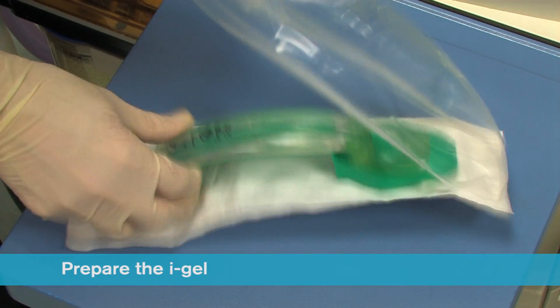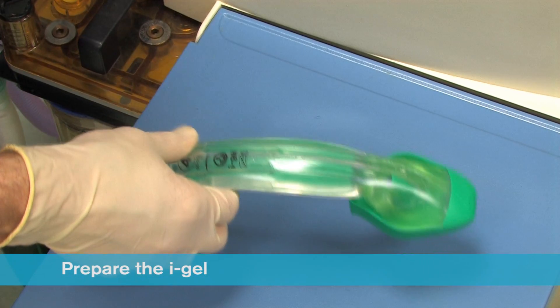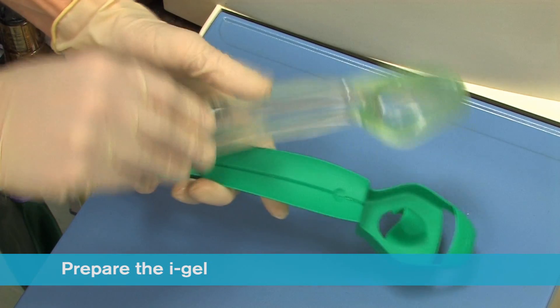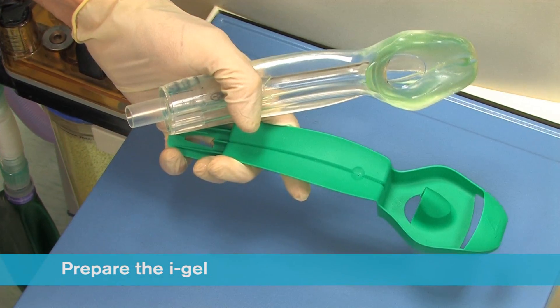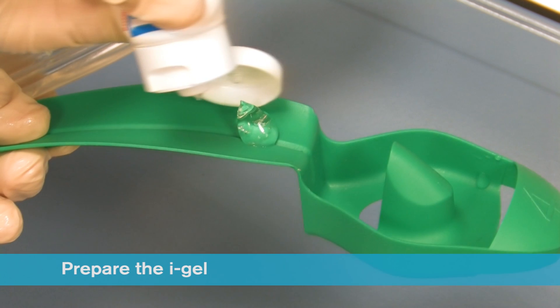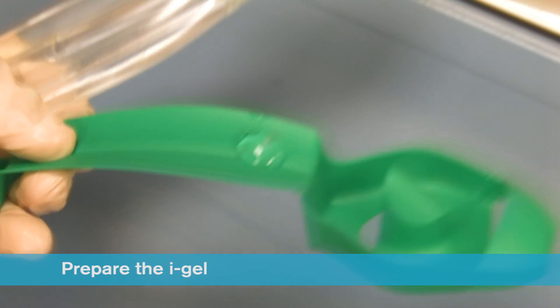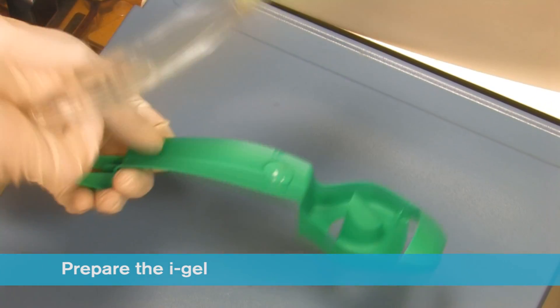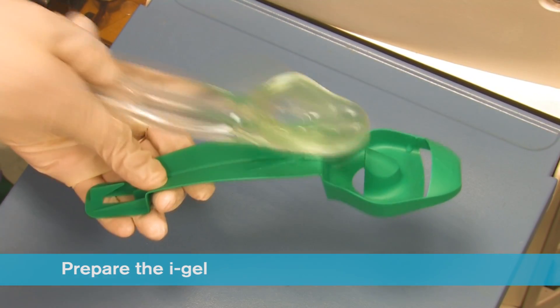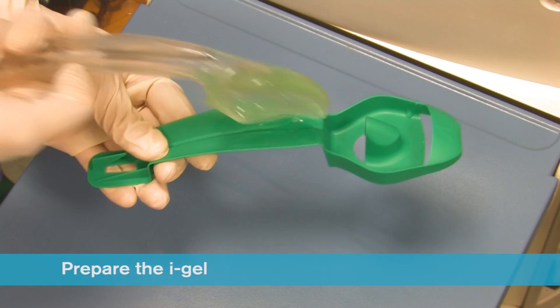Ensuring that you conform to local policy for hygiene, open the iGel package and on a flat surface take out the protective cradle or cage pack containing the device. In the final minute of pre-oxygenation, remove the iGel and place a small bolus of a water-based lubricant such as KY Jelly onto the middle of the smooth surface of the cradle or cage pack. Do not use silicone based lubricants. Grasp the iGel with the opposite free hand along the integral bite block and lubricate the back, sides and front of the cuff with a thin layer of lubricant.